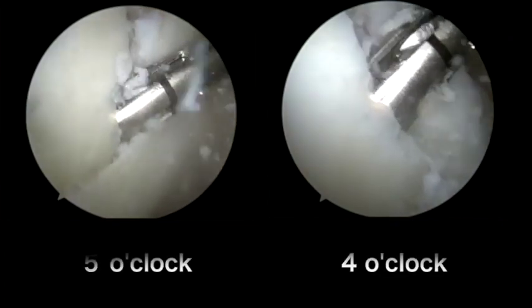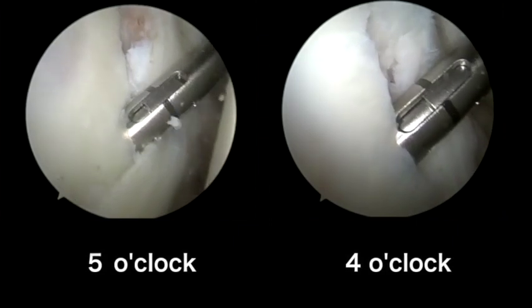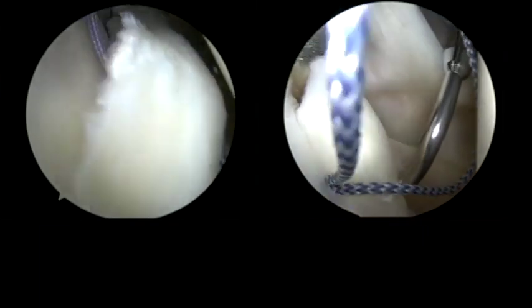To avoid creating excessive bumpers, the same procedure is repeated to repair the IGHL complex until it reaches the 4 o'clock position.